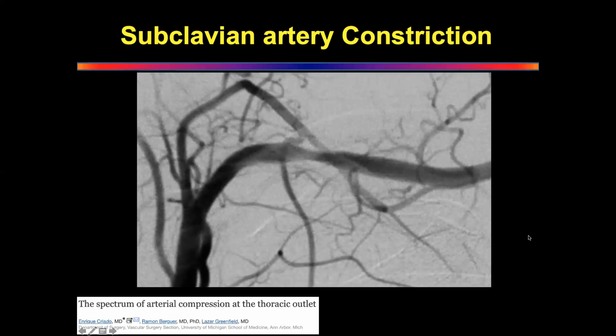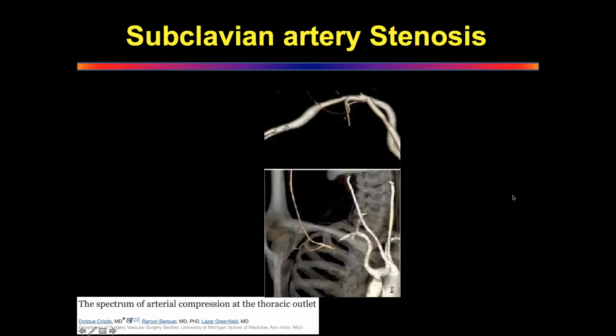Okay, so digital subtraction angiography is just an image manipulation, a bit like doing it on photographs that you manipulate. So first is normal anatomy without dye, then with dye, and both are placed one on top of the other, and the surrounding is all subtracted. Then you get only the picture of the filled up artery, whichever artery that you do. Okay. All right. So this is showing you stenosis.